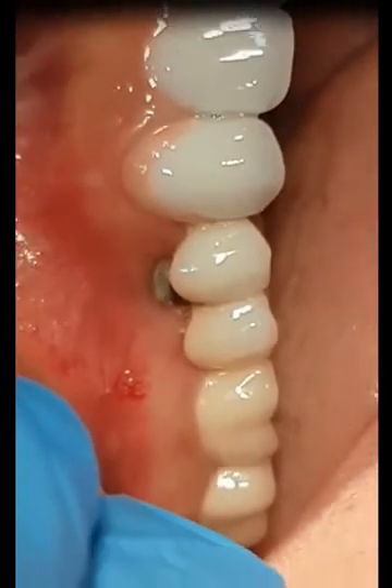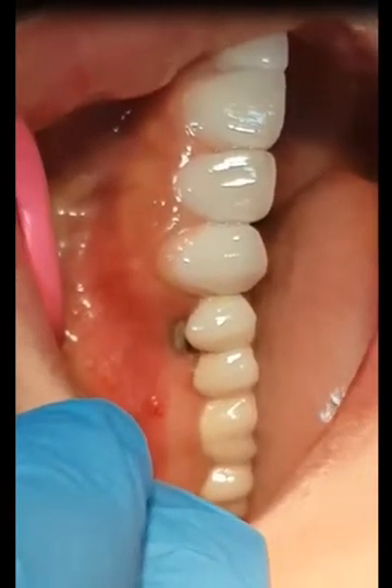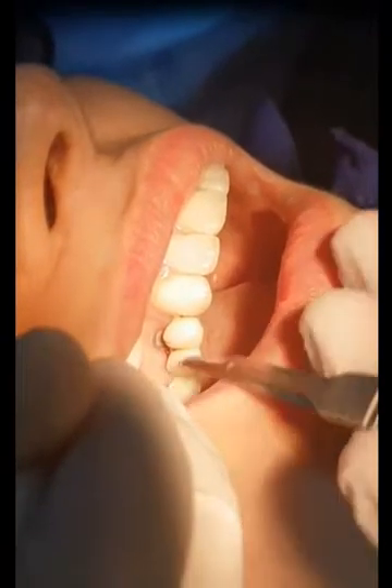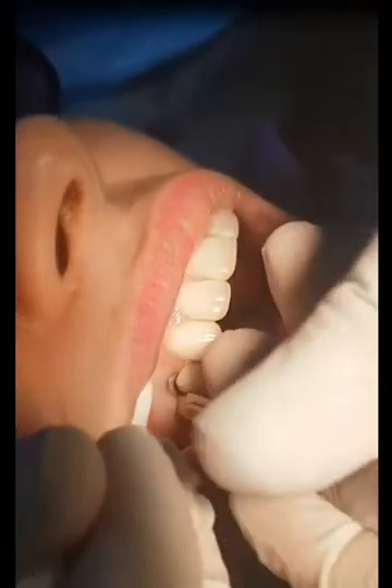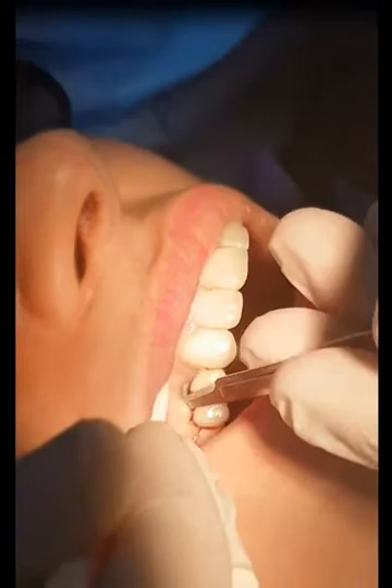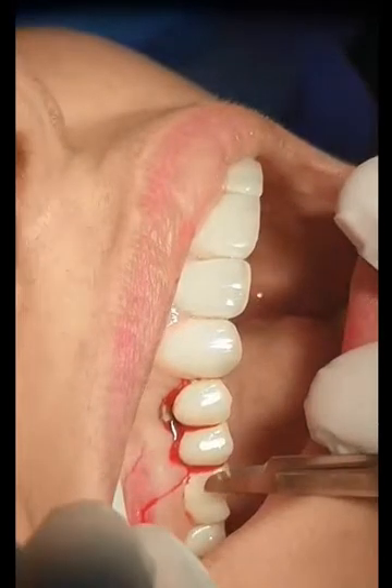We are trying to design the flap. We are doing the split papillary flap — we have papillary preservation flap and we have split papillary flap. We are doing the incisions. While doing the incision, it's desirable that you make an incision remote relative to the placement of the barrier membrane. For example, this is the area of defect — we do the incision one tooth away from the defect, one tooth on each side.